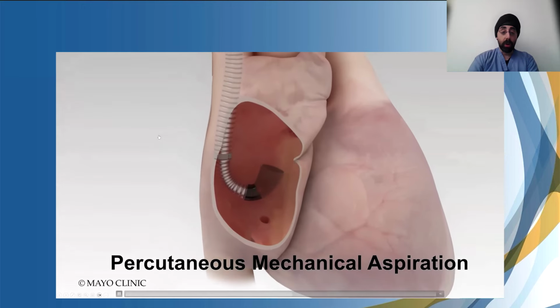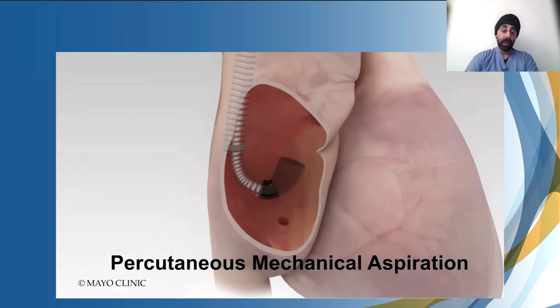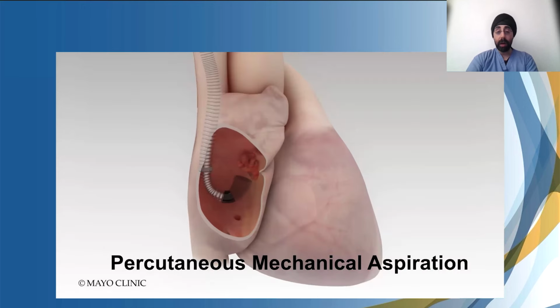So we'll talk a little bit about percutaneous mechanical aspiration. I think the role for it is still evolving. So I think, as I've said a couple of times, we understand that all these patients should be on appropriate medical therapy.